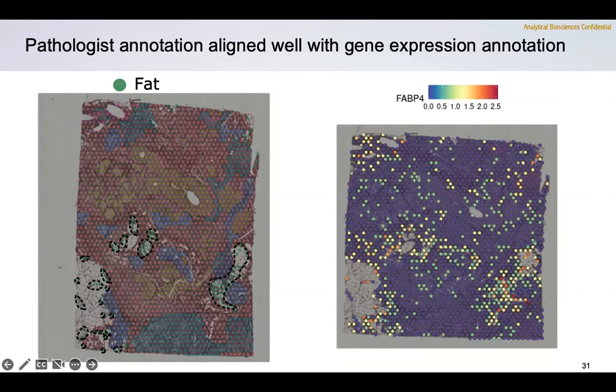One of the cell types or tissues that we would expect to see in breast tissue is the adipocytes, or fat cells. That annotation was missing from our SPOTlight because the single cell data that we used for the deconvolution didn't have any fat cells, because of how they dissociate the tissue and do RNA capture.